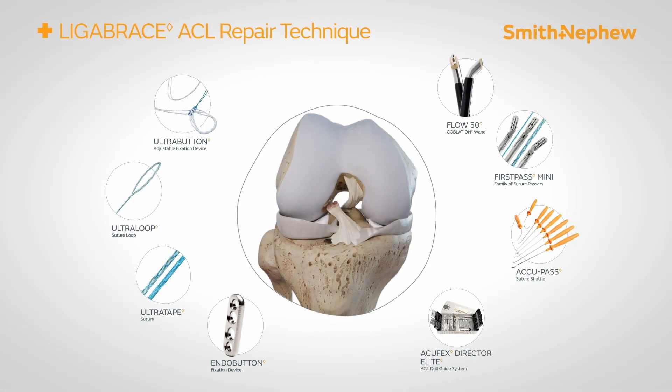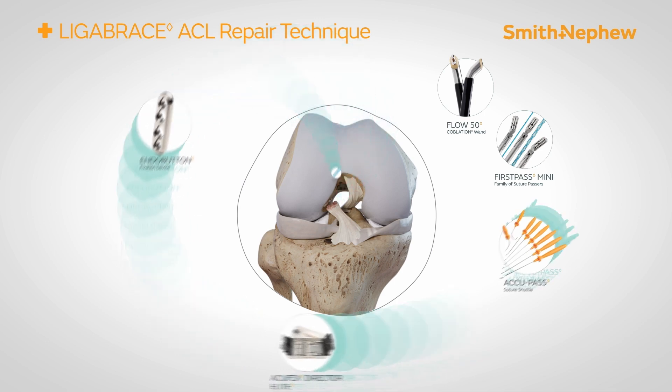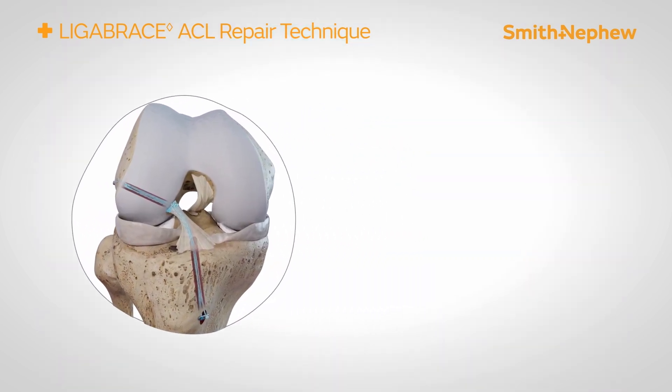The Smith & Nephew Ligabrace ACL repair technique reimagines reconstruction with repair.